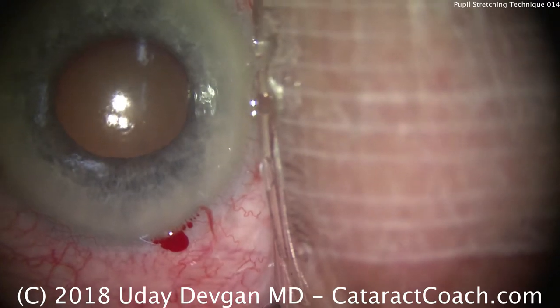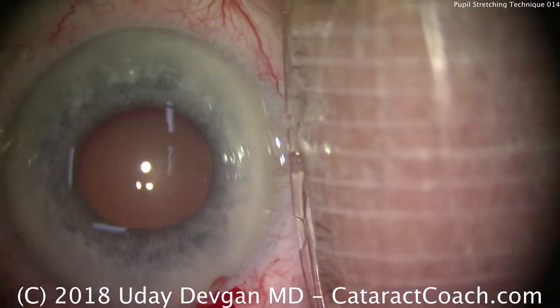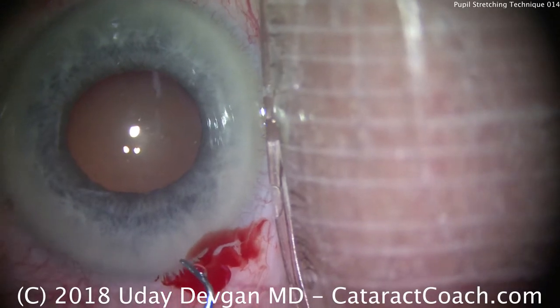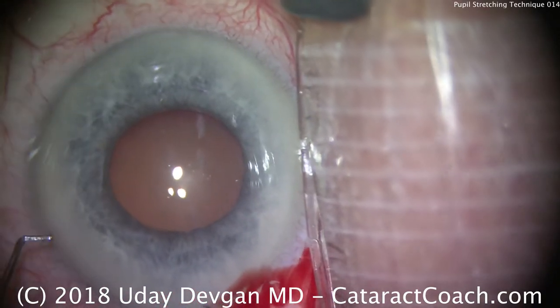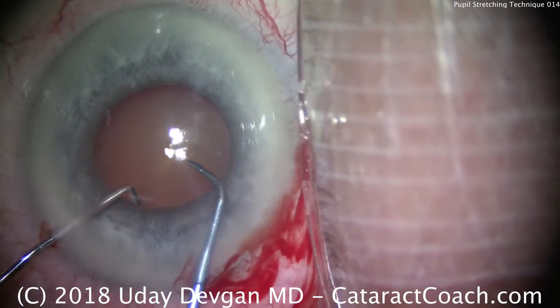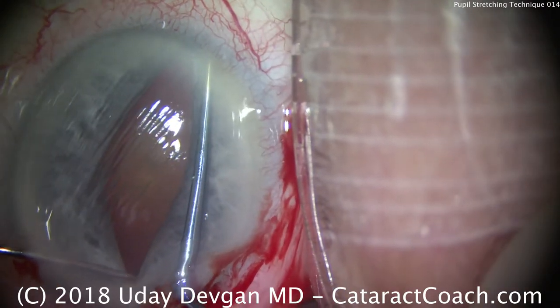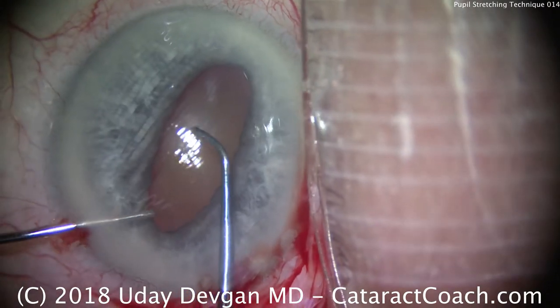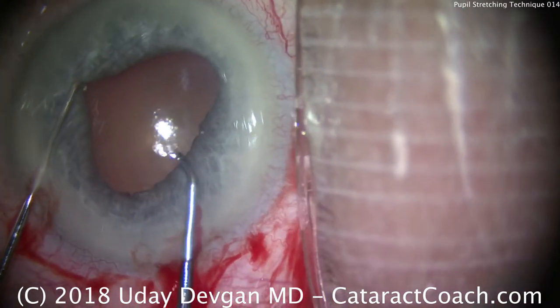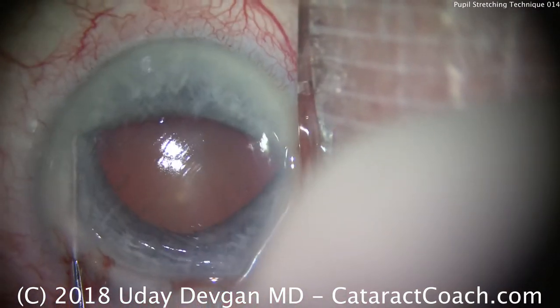We're now going to use two instruments — a chopper in each hand. You can use multiple other instruments: some sort of iris hook, a Sinskey, your own chopper, a pupil manipulator, a Y-hook, anything. We choose two points 180 degrees away, secure the pupil margin, and push towards the angle of the eye. Then move our instruments 90 degrees away and do the same thing, towards the angle of the eye, stretching it out. And that's going to be sufficient.